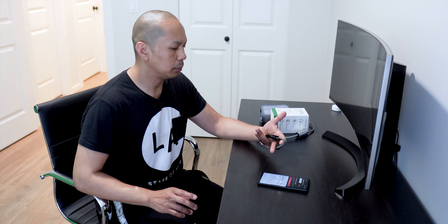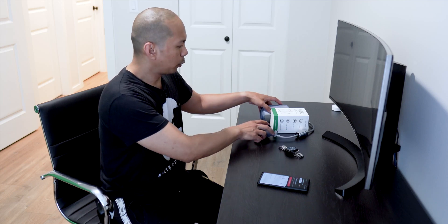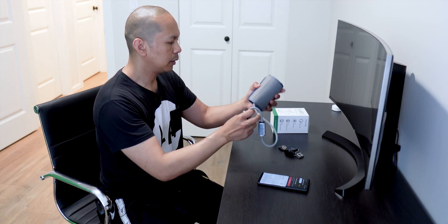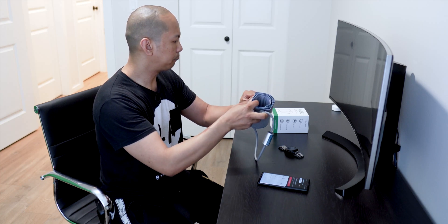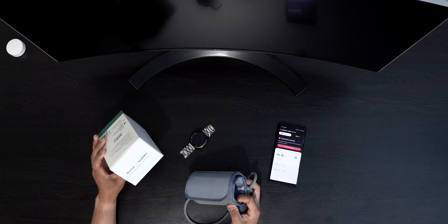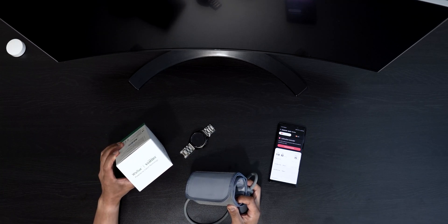I already connected it to my Note 9 via Bluetooth and downloaded the application. For the calibration I will be using this awesome portable blood pressure device — it's called the Air Blood Pressure 2 from Welu Vitum.